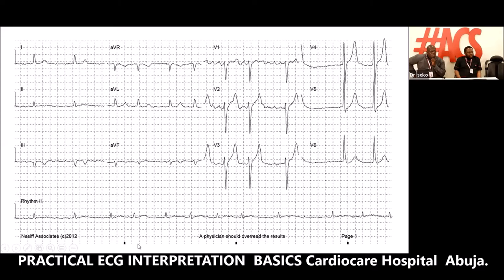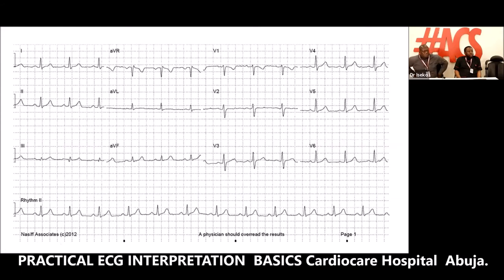No, you have changed the slide. No, you've changed the... Oh, sorry. Okay, are the RR intervals equal? Virtually, they are. Okay? They are equal.